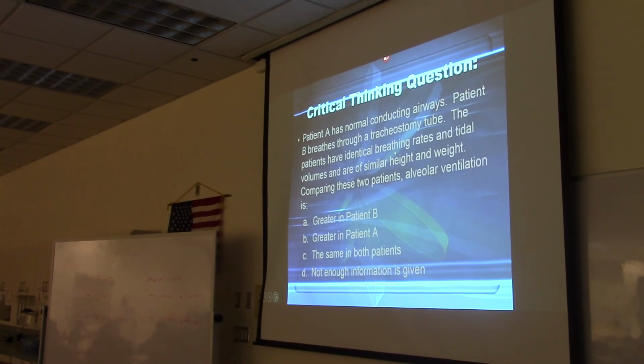So there's no oropharyngeal dead space at all. The air is just going right into the trachea. So, same tidal volume, which one would have more air going to the alveoli? Patient B. Yes. So the answer is A.